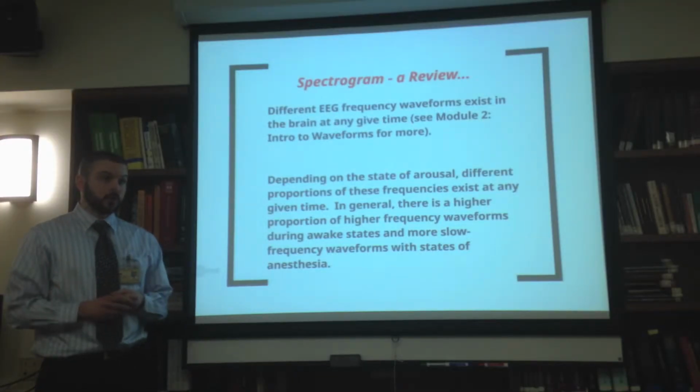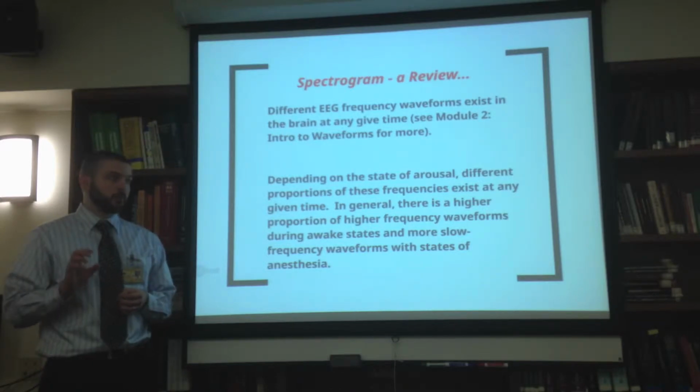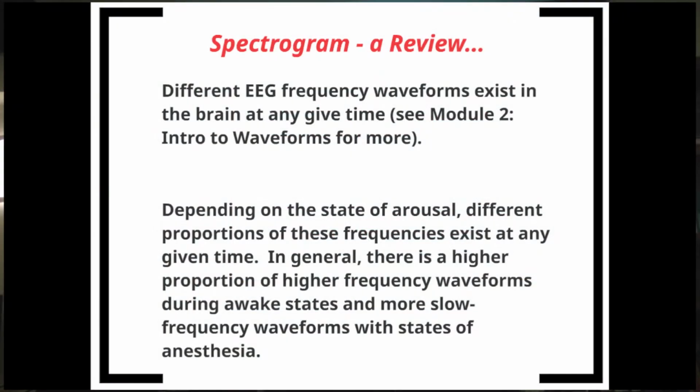And in general, there's a higher proportion of higher frequency waveforms during arousal and awake states, and typically more slow frequency waveforms are present in states of anesthesia.